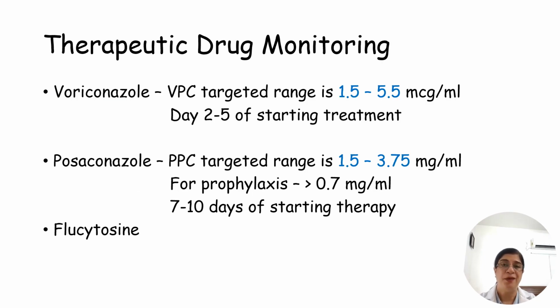Yet another important diagnostic test which should be available in a mycology lab is therapeutic drug monitoring. Voriconazole and posaconazole have a very narrow therapeutic index because of their high toxicity at higher levels, and significant drug-drug interactions mean that we should monitor their adequate plasma concentrations, and it should be closely regulated.